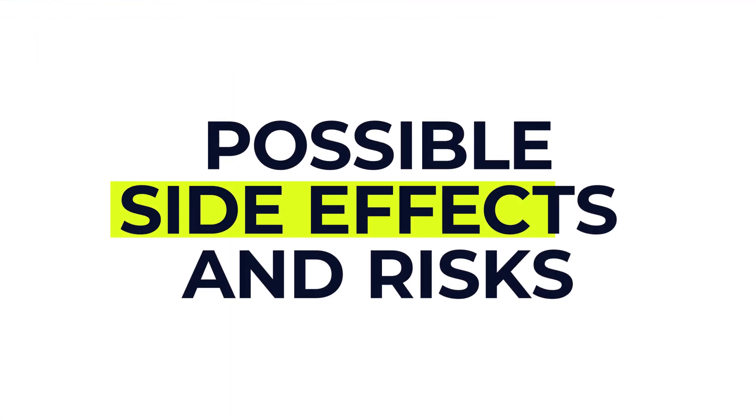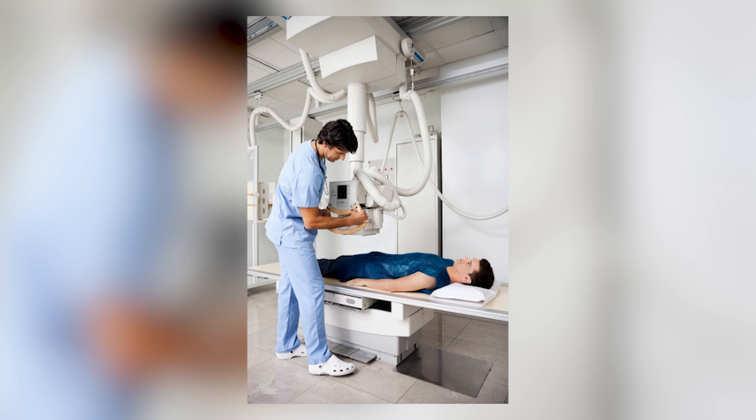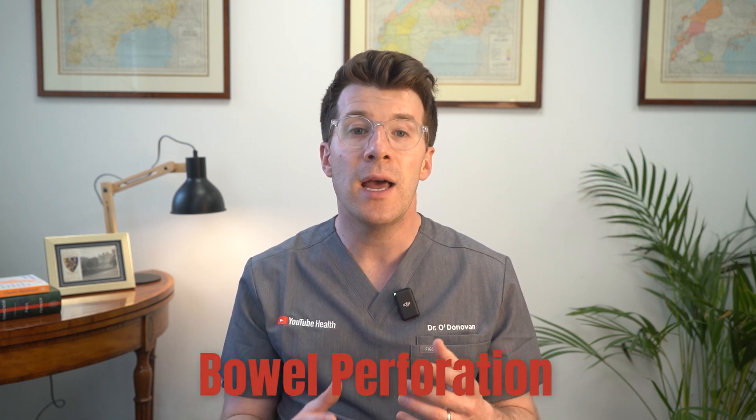A barium enema is generally a safe test but like any procedure there are some side effects to be aware of. These may include feeling sick, bloated, or getting a mild headache from the laxatives, and temporary constipation after the test. In very rare cases there can be an allergic reaction to the barium. It's important to tell your doctor if you think you might be pregnant, as you'll be exposed to a small amount of radiation — about the same as what you'd naturally get from the environment over around three years. A very rare complication is a bowel perforation — a small hole in the bowel lining — but this is extremely uncommon.